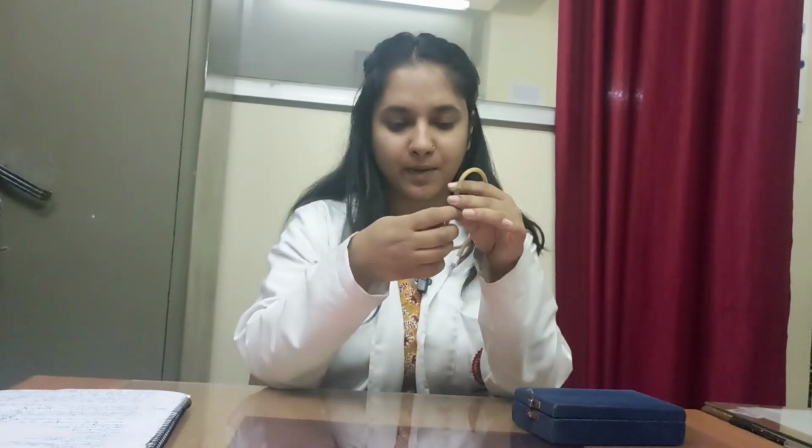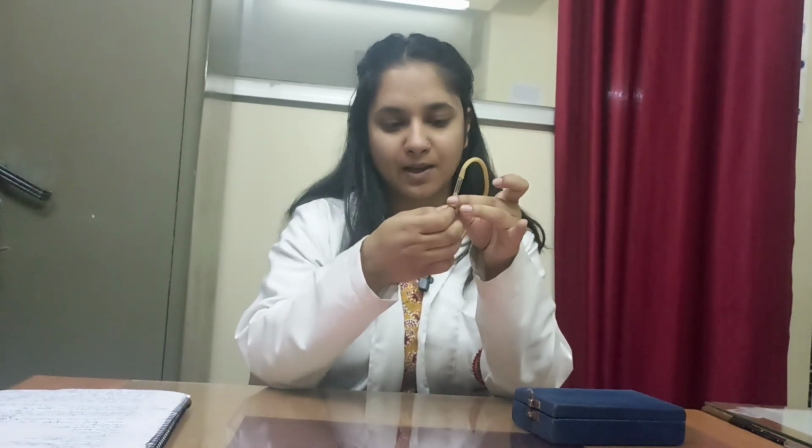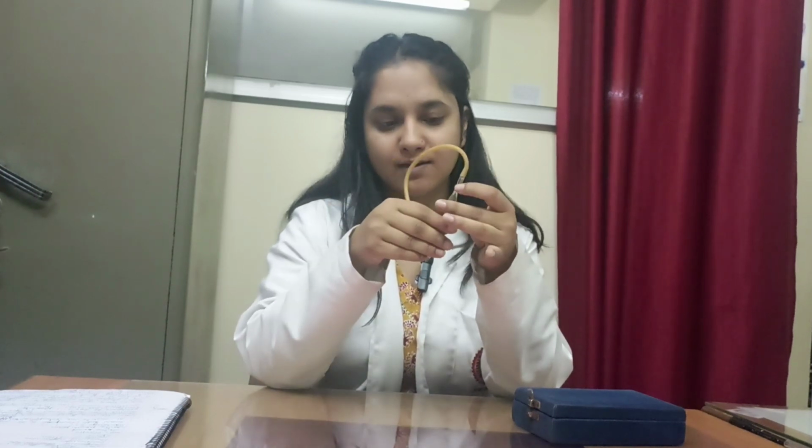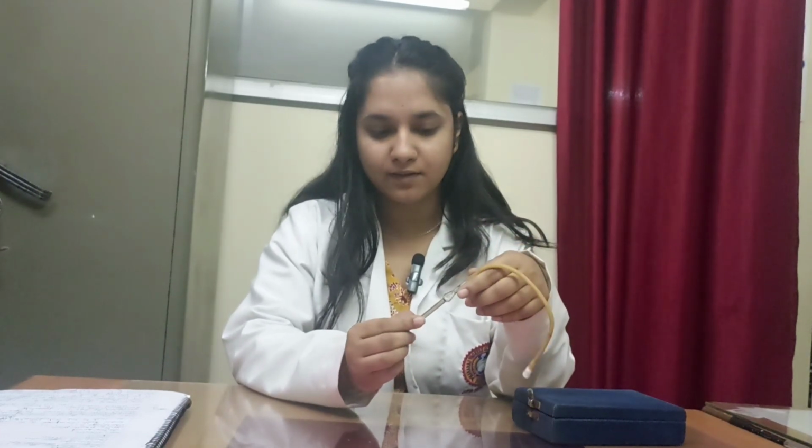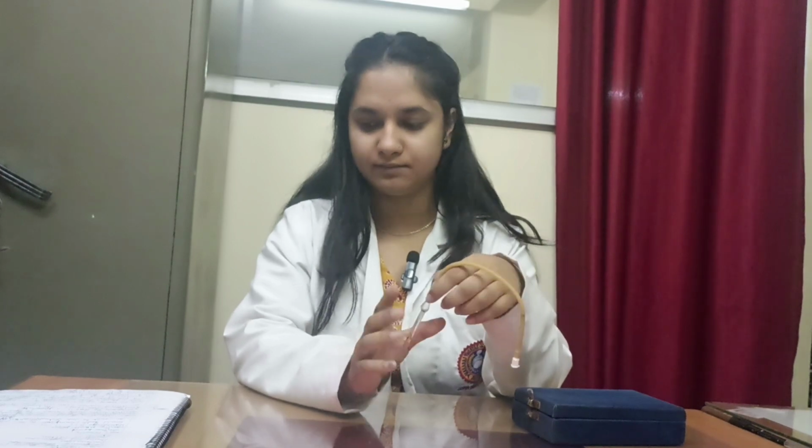In the WBC pipette a white bead is present, and in the RBC pipette a red bead is present. The mouthpiece is white in color in the WBC pipette, and the mouthpiece in the RBC pipette is red in color. There are some markings on the WBC pipette. These markings are 0.5, 1 and 11.